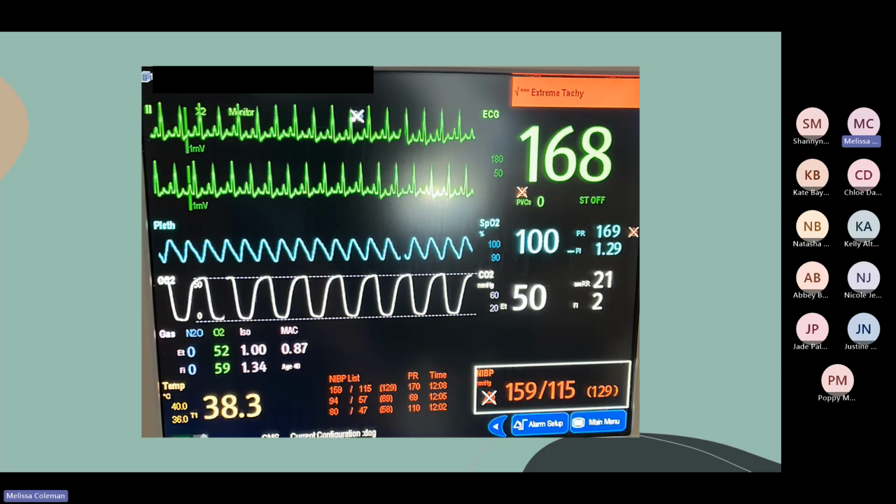We've just given the atropine, so we would expect this general thing to happen. You will see they can go quite tachycardic, and they can go quite tachycardic quickly. Sometimes it will take up to a good 3 to 4 minutes, and then you will see your next couple of blood pressures go up, and then they should start to taper down and become slightly more normal. But it stayed kind of like this for the rest of our GA. So she's pretty happy now, and then she's woken up really nicely. You've had the previous blood pressure reading. Treated it. Yeah.